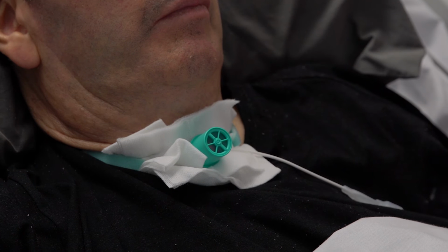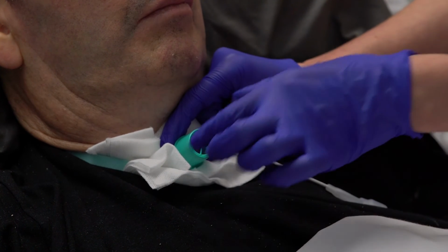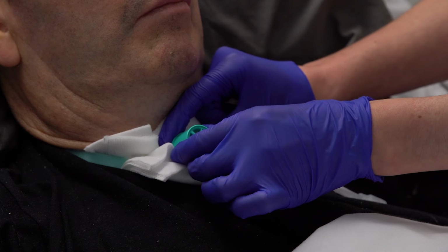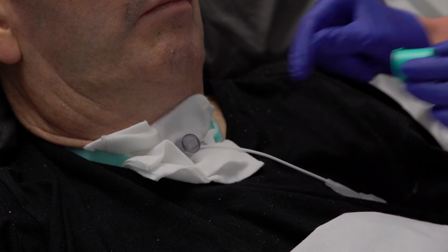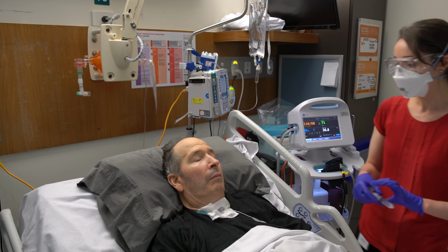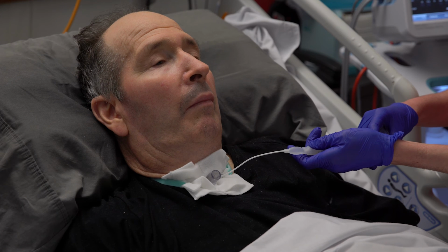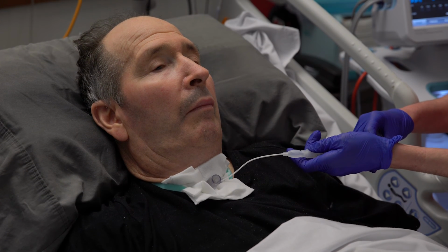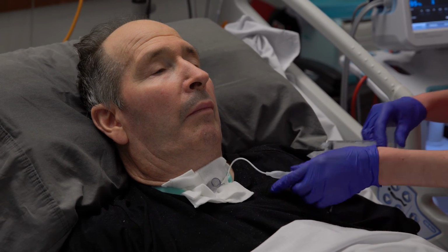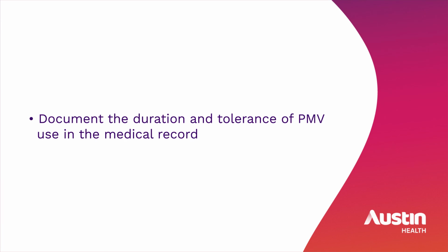So to remove the speaking valve, we'll place one hand on the tracheostomy hub, and then with a quarter anti-clockwise turn, we're going to remove the speaking valve. Re-inflate the cuff as required. Document the duration and tolerance of PMV use in the medical record.